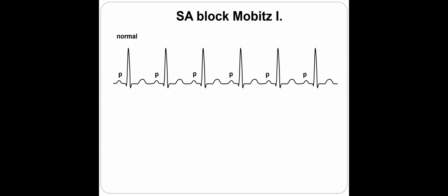If you go back and measure how the PR is changing and how the RR is changing, what I said at that time, you will understand in Mobitz type 1 AV block, the RR is getting shorter. It's very similar. However, I cannot point to which is the sinus activation. But that is identical: where in AV block we had the RR changes, here the PP changes are the same.